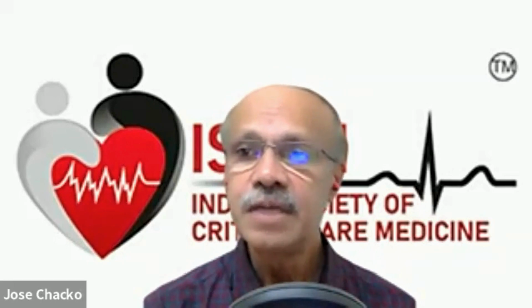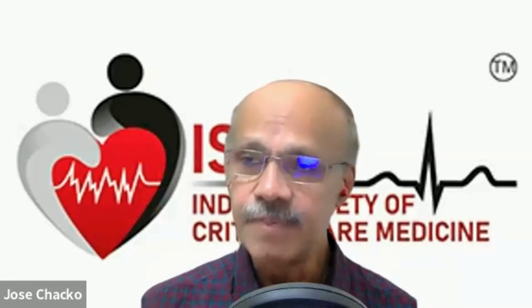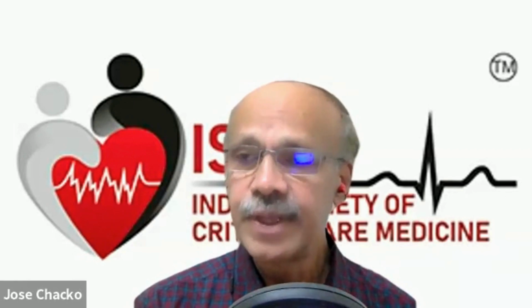We use PEEP fairly randomly without really looking at if it is actually going to help the patient or not. For the application of PEEP to be effective, it needs recruitable lungs. If the lungs are not recruitable, regardless of the level of PEEP you apply, it will not reflect as obvious clinical changes.